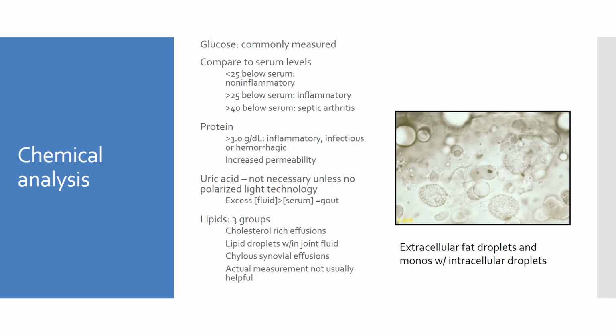The increased uric acid level would usually be associated with a patient who has gout. We also do cholesterol levels. Again, our RA patients frequently have increased cholesterol levels in their specimens, and so identifying a total cholesterol level could be useful.